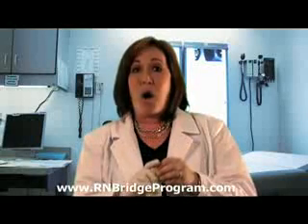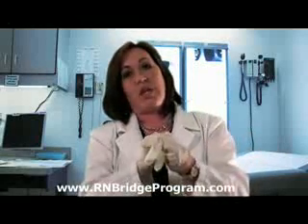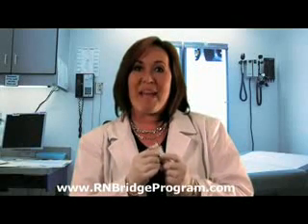Your hands need to be washed prior to your procedure. And then we're going to put these clean gloves on. And then once we get the gloves on, we're going to take the alcohol, because another part of asepsis is actually cleaning the site with alcohol. So now let's go down to our patient.